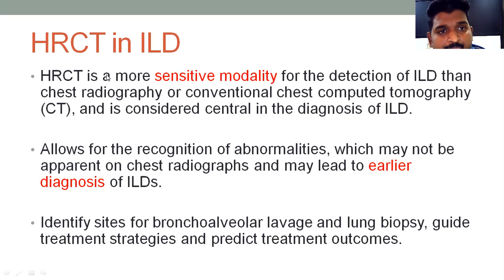It's a more sensitive modality for detection of ILD, particularly ILD in the early phase, than a chest X-ray or a conventional chest computed tomography, and is considered central in the diagnosis of all interstitial lung diseases. It also allows for the recognition of abnormalities which may not be apparent on the chest X-ray in the initial phase and may lead to earlier diagnosis of an ILD.